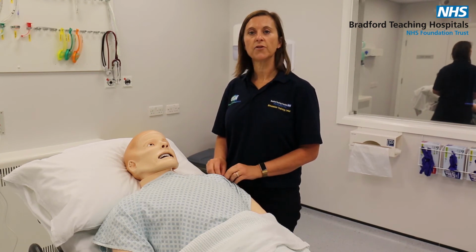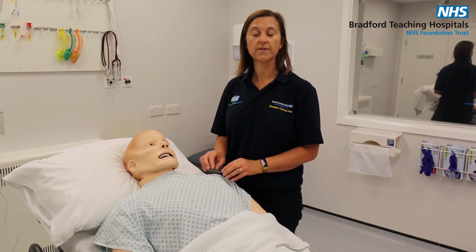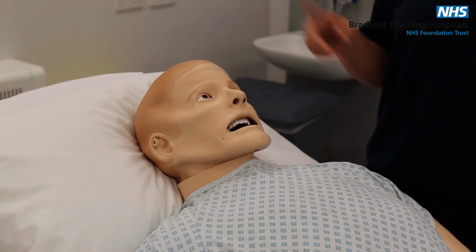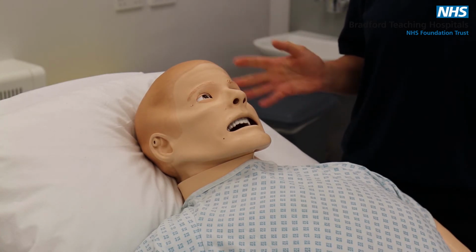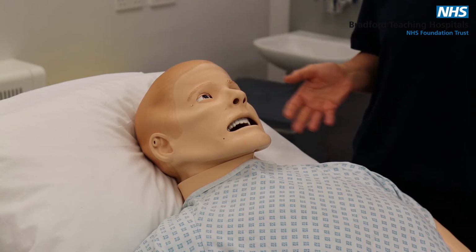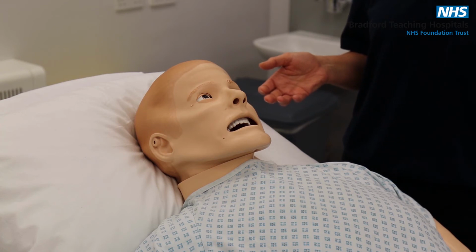So this is Simman 3G. He is a high fidelity tetherless mannequin, and he's the mannequin that will be used for this session today. So one thing that we can't change is the colour of Simman's skin. Sometimes obviously in clinical areas the pallor of the skin changes, but we cannot simulate this, and this is what we would class as simulation artifact.